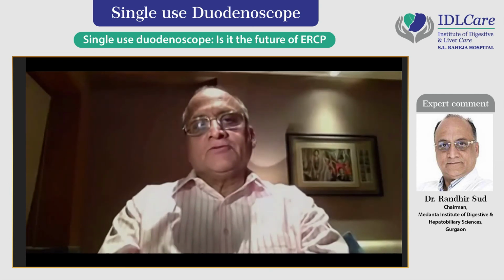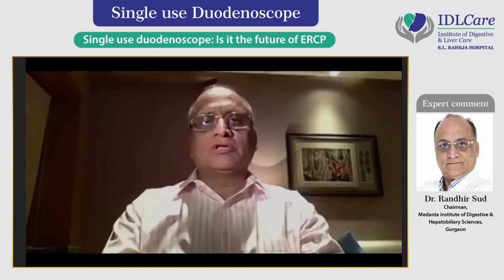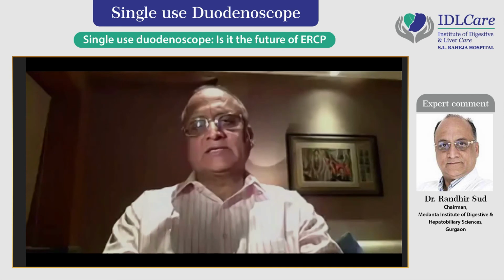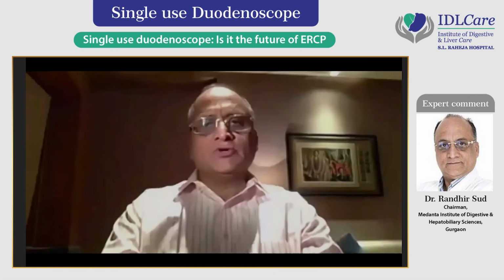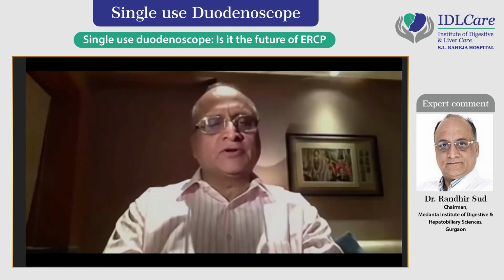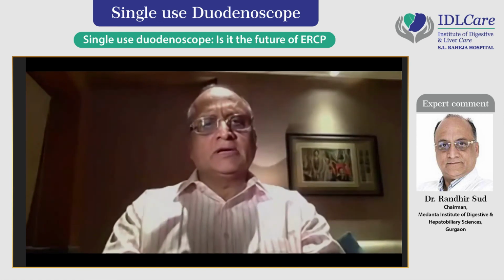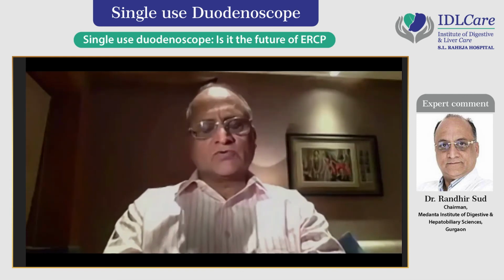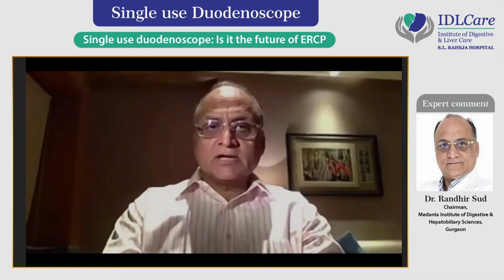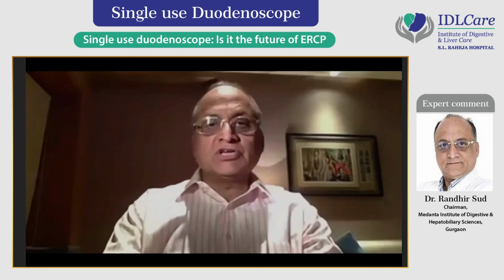In fact, as Mohan said, technically, if you see the usability of this scope, I don't think it has many disadvantages, except, as he mentioned, it is slightly rigid. Whenever you use a new scope, you need to give some time before you get used to it. We did cholangioscopies with it. We did pancreatic endotherapy, biliary endotherapy, and we found it to be easily masterable. So it's not something which has a technical disadvantage. The biggest disadvantage is the cost and disposal of the equipment, because after all, you are adding a substantial amount.